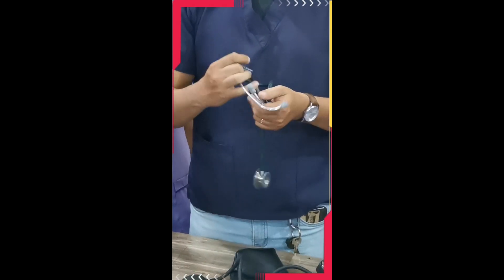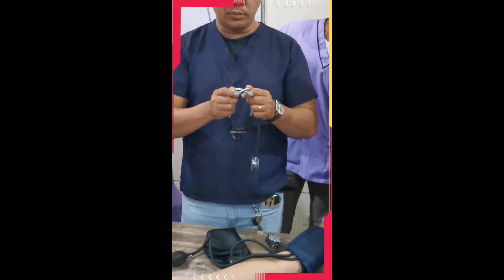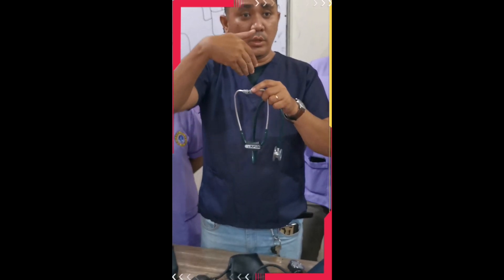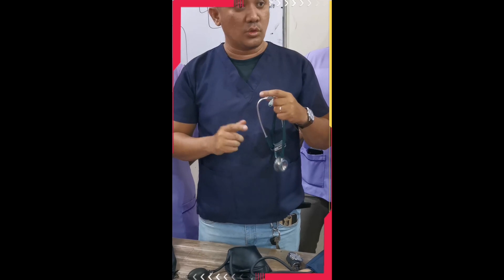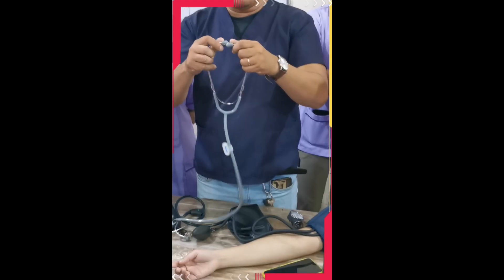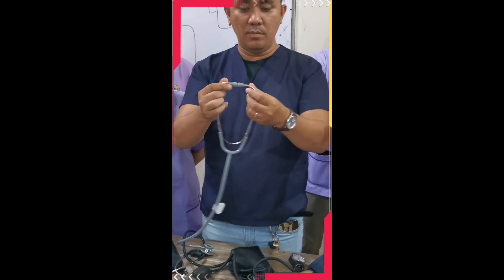Now prepare your stethoscope. Make sure the earpieces are facing forward — toward the outside — so that when you place them in your ears, they go directly into your ear canal. If the earpieces are facing the middle or inward, they will sit outside your ears and you will have difficulty listening to sounds. Bend the binaural so the earpieces face forward. That way when inserted, they properly enter the ear canal.